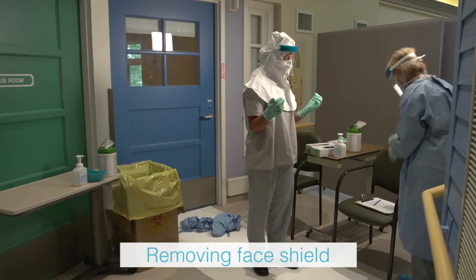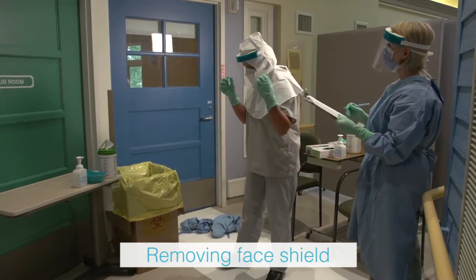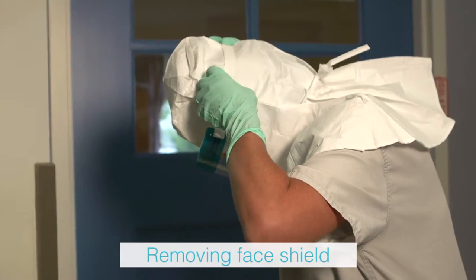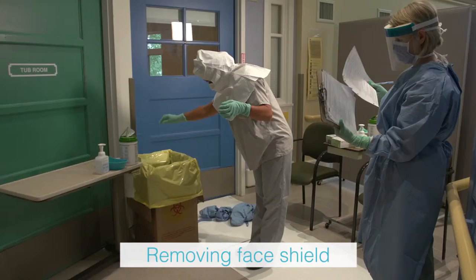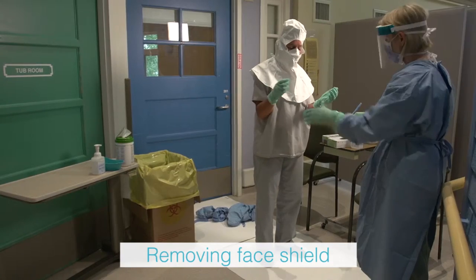The health care provider removes the face shield by handling only the rear strap, as the front of the shield is considered contaminated. The shield is pulled up and over the head, gently allowing it to fall forward. Place in the waste receptacle.